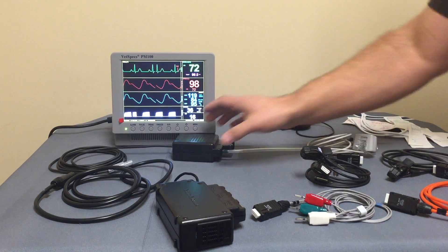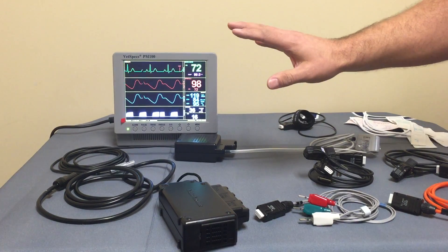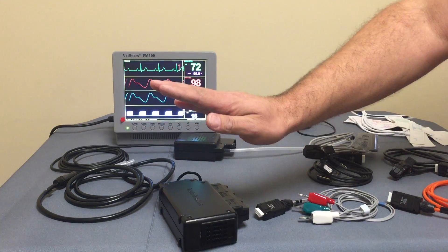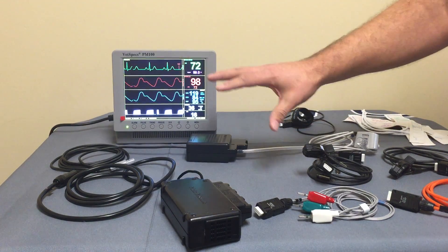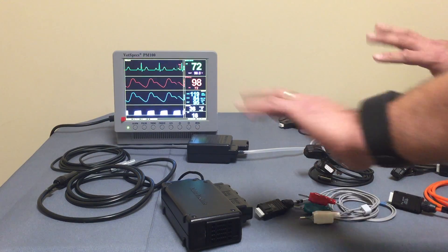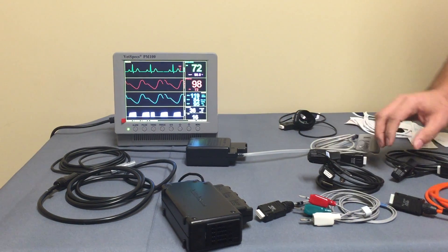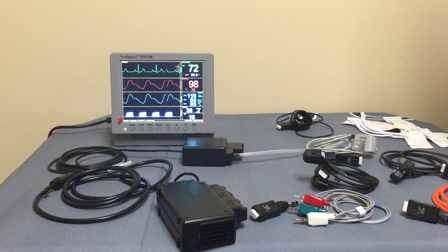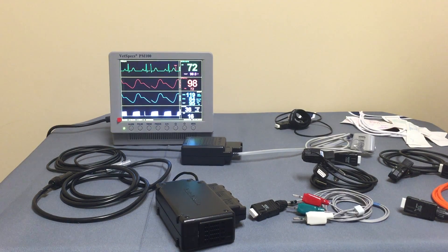The blood pressure module was intentionally designed as a separate module because your main module will generally be at the head of the patient, while your blood pressure module will generally be located more at the rear of the patient — on the rear leg or tail. It's nice to have the two pieces separated out. VetSpecs has gone outside traditional thinking and manufactured a blood pressure system that is a two-part design.